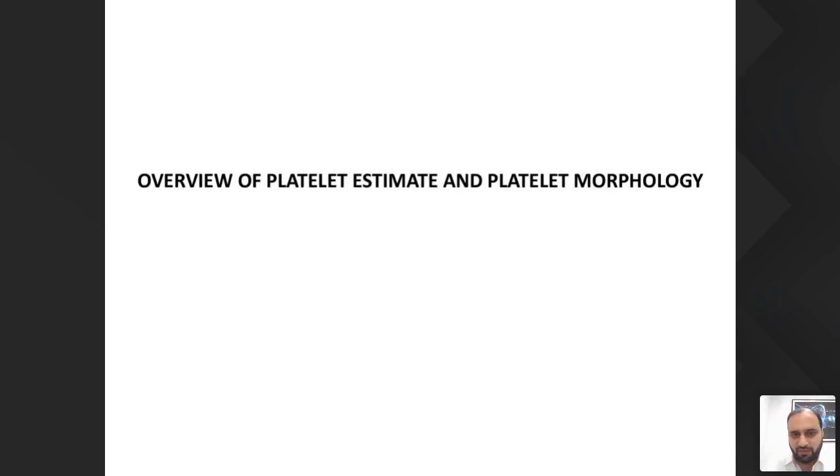Next, I will quickly go through the platelet estimate and platelet morphology, because in the second session there were many doubts regarding platelets, so I came up with this idea that I'll put in a few slides on platelet estimate. I am sitting in an area where we have this Harris syndrome or the giant platelet syndrome. My slide criteria would have been much less had it not been for this giant platelet syndrome. I see almost 100 slides of only platelet abnormality, and the platelet abnormality is a platelet count in between 50,000 to 110,000, and eventually I report it out somewhere between 1 lakh to 160,000.